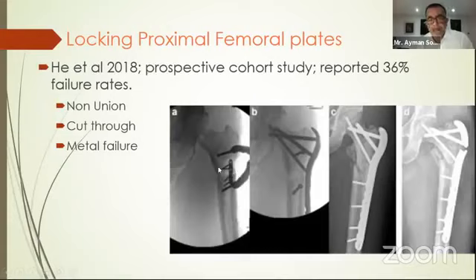But for subtrochanteric fractures, again, as the trochanteric plate is extramedullary, even with a strong titanium design, they still fail. And the failure rate is quite high, whether that is due to cut through or mechanical failure. Is that something that we don't use? We still use them. There's still much use for them, and there's definitely a place for them in failed neck of femur surgery.